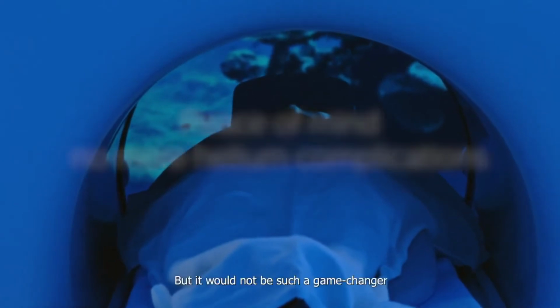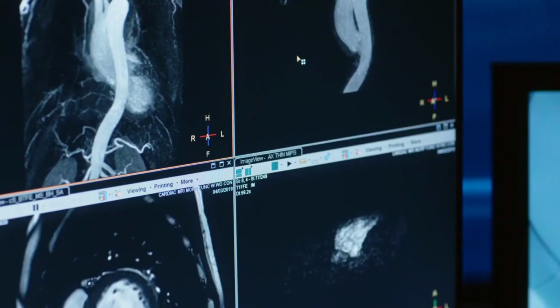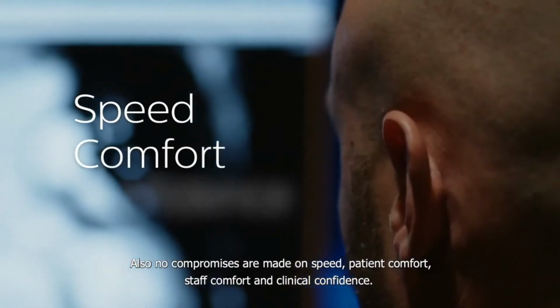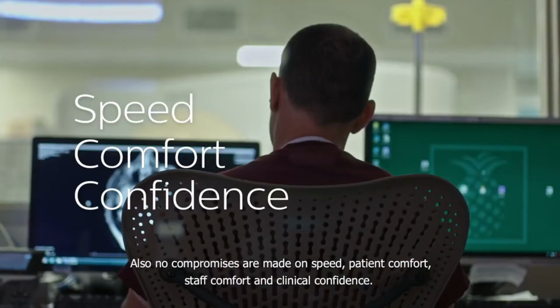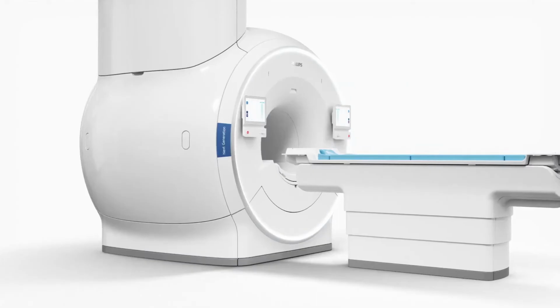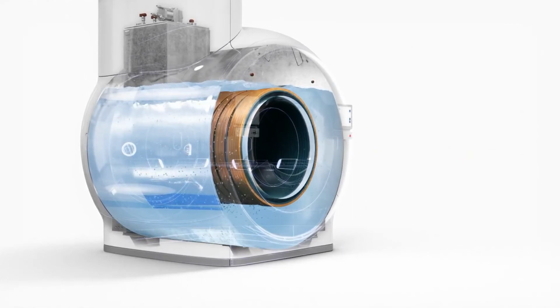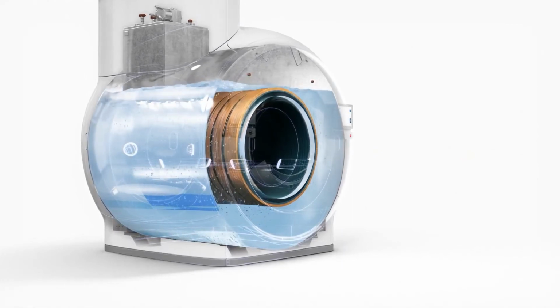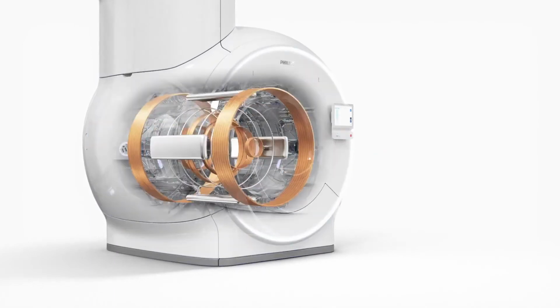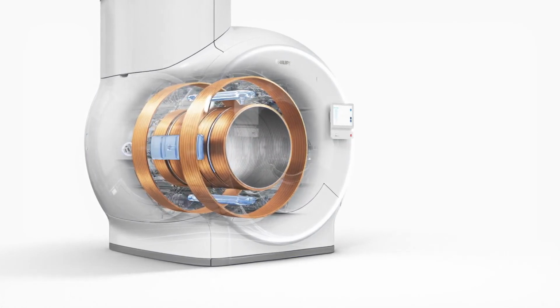Magnets with Helium-less technology are designed to be less dependent on helium, much easier to site, and eco-friendly. Thanks to Helium-less technology, hospitals would no longer need extensive venting that often necessitates siting a magnet in a separate building or newly constructed room. Additionally, a Helium-less magnet would not need any refilling during transportation nor throughout its lifetime. Therefore, when the Helium-less technology is integrated into a commercialized product in the future, it could make MRI more accessible and less expensive to site and operate.